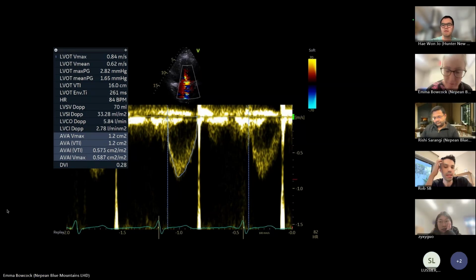Yeah, so I'd say that the aortic valve is bicuspid, and it appears to be a true bicuspid aortic valve with no evidence of a raphe. So that's how it appears structurally. Nice. On 2D, there didn't appear to be significant restriction to motion, but on Doppler assessment, our values are giving us a moderate aortic stenosis.